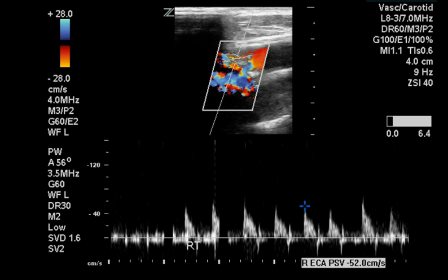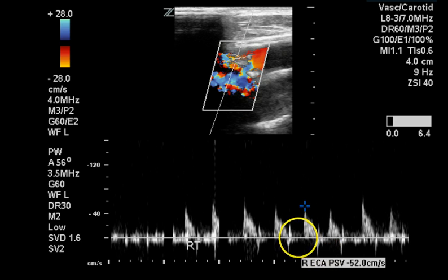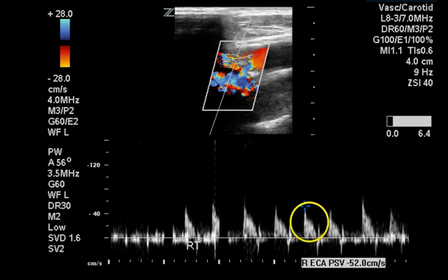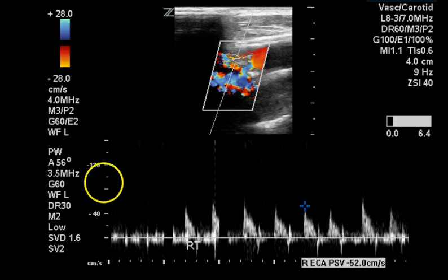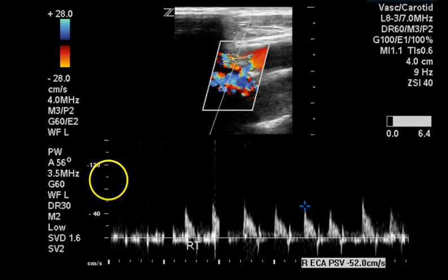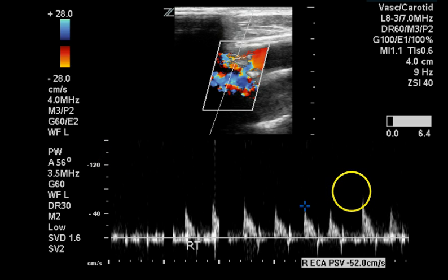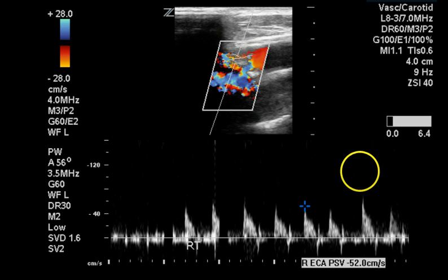The right external carotid artery has a normal shape to its waveform, has some reverse flow which is normal for this vessel, and does not show a clear spectral window — possibly due to the small size of these waveforms. The scale could have been changed to 60 centimeters per second instead of 160, which might have made the spectral window visible.